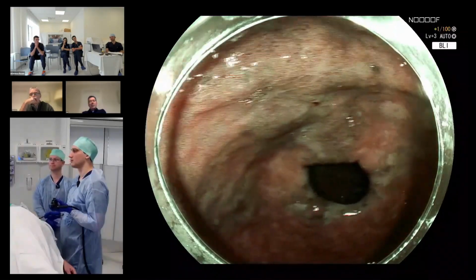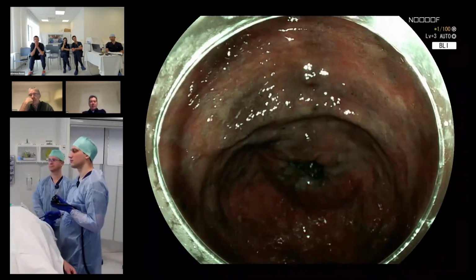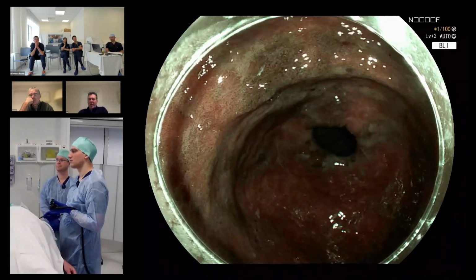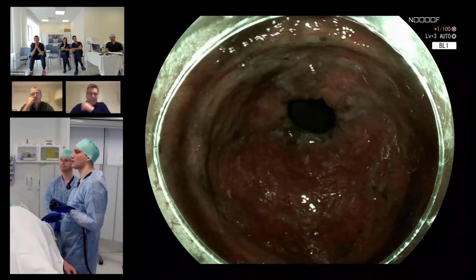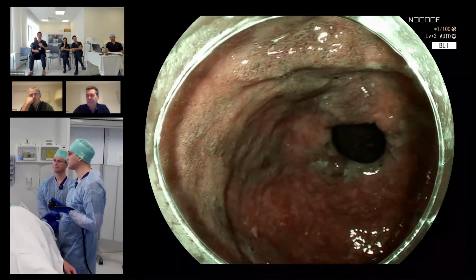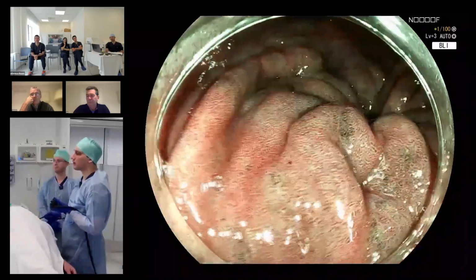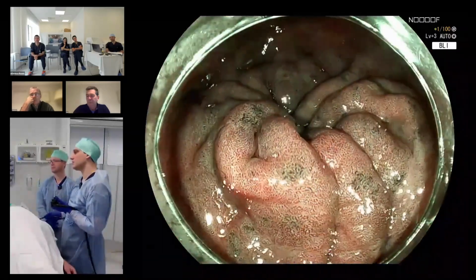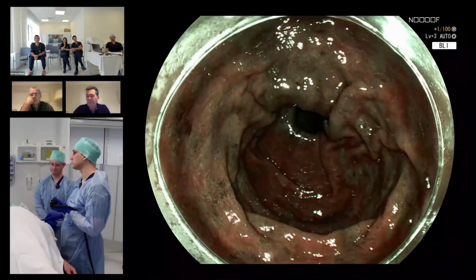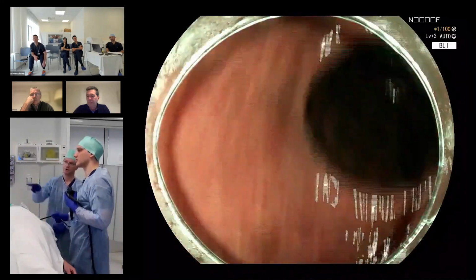So, I mean, David, I've seen you coaching Michele very nicely to slow down. I mean, Michele, we have to say Michele is very much at the start of his endoscopic career. So that's the first thing, for example, Michele, you have a cap on. Do you want a cap on right now? Is it helping you, or is it actually making it more difficult? I think that now that I want an overview, maybe it is not helping me, but okay. So take it off, and let's do our overview assessment first. Yeah, we'll go back to white light.